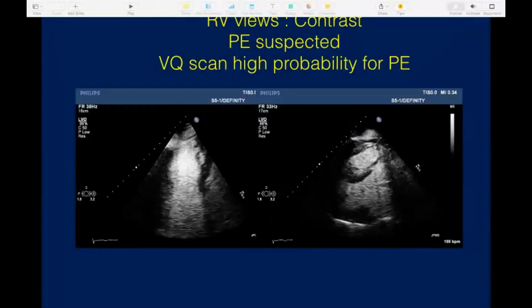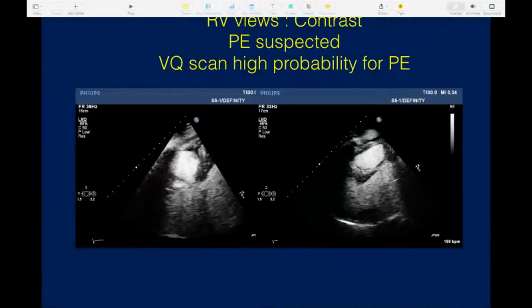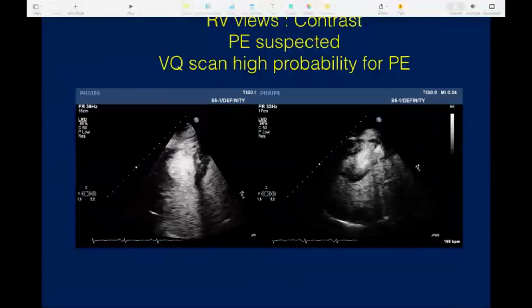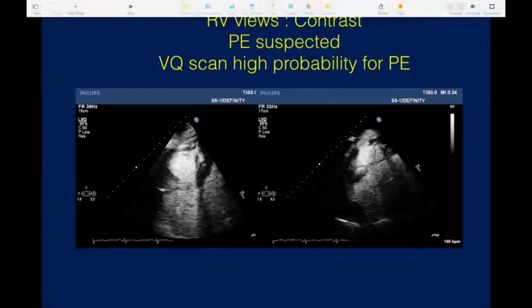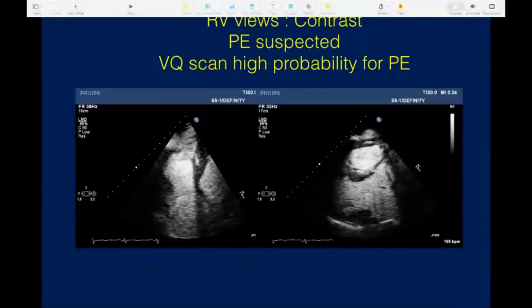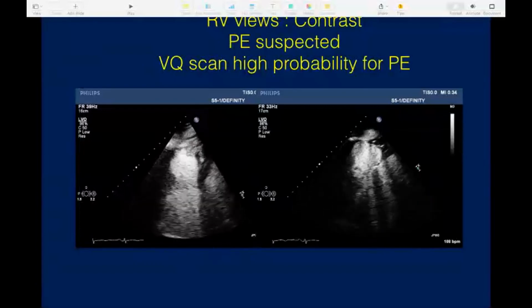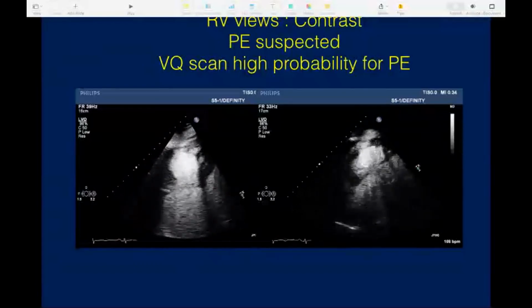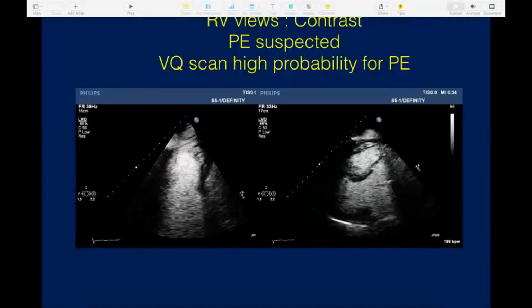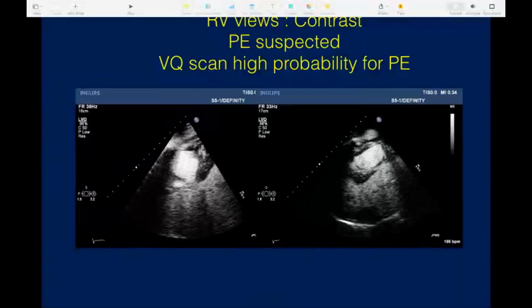I'm sure you all do thousands of echoes. We do about 20 to 21,000 echoes per year. So that would be a substantial financial burden. Having said that, the one area, and even the American Society of Echo recommendations say this, is cardio-oncology. And I think this is very crucial, regardless of left ventricular image quality. Cardio-oncology is an area where contrast imaging should definitely be considered at a very low threshold to be used routinely.